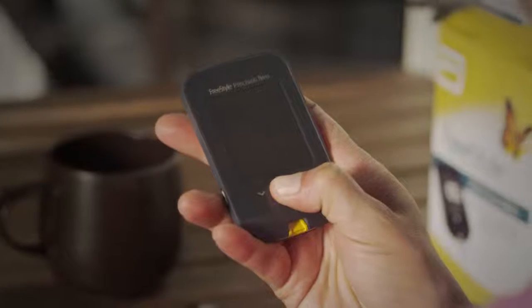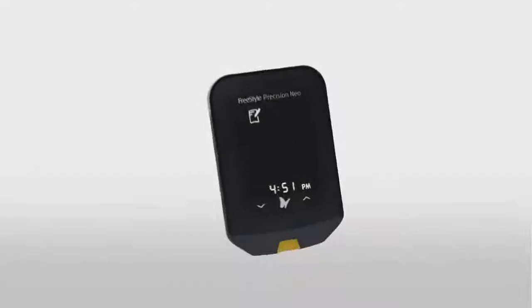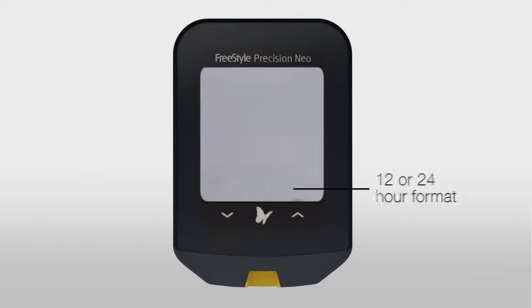Turn your meter on by pressing the butterfly icon. Let's first set the time and date by pressing the time and holding for three seconds. Choose either a 12 or 24-hour format, then press the butterfly to save and continue.